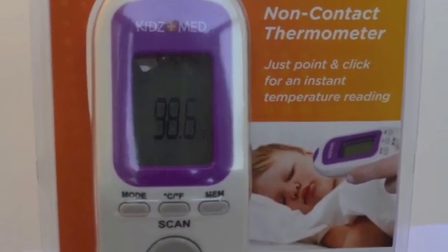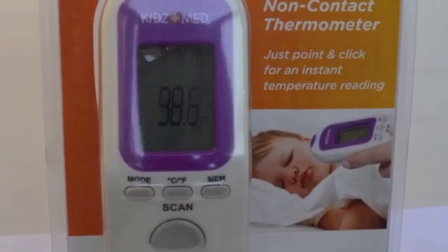There's been a lot of interest in the Veritemp and a lot of questions — how accurate is it, how does it work? Let's start with how does it work. It uses totally safe infrared technology to measure this part of your skin — the forehead, which is very vascular and very close to your heart.